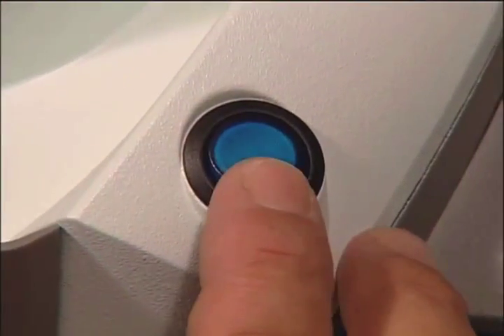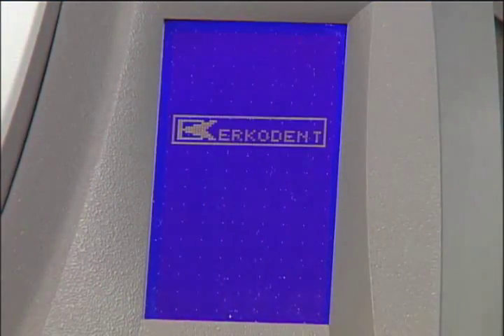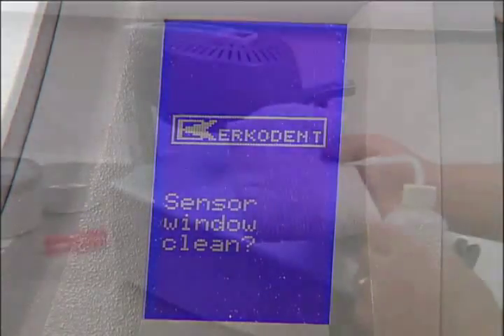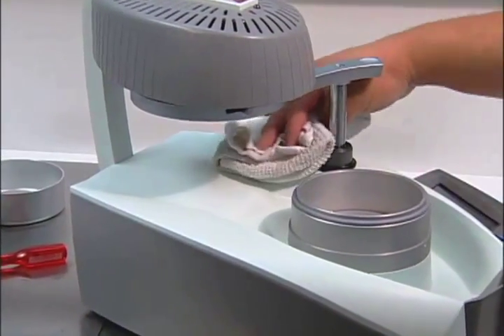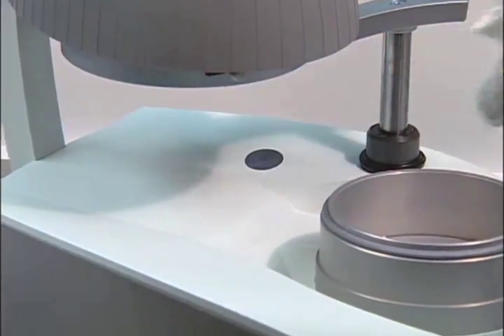Turn the unit on at the main switch. The touch screen panel will display ErkoDent and then Sensor Window Clean. Use clean water to moisten the cloth to wipe the sensor clean. Make sure that the sensor window is free of dust and dirt to avoid measuring mistakes.